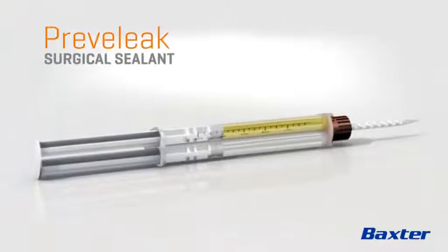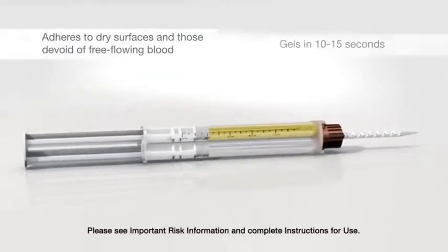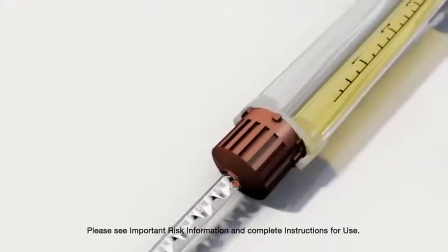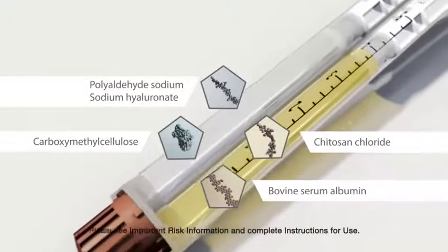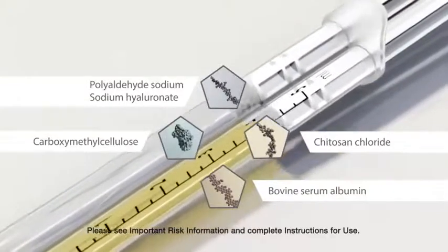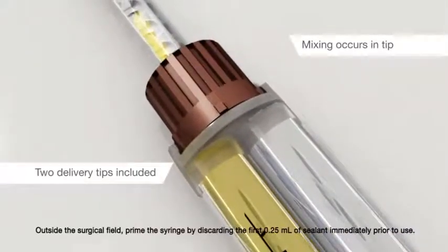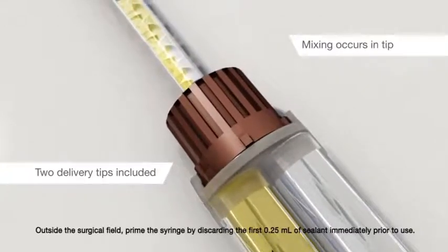Baxter Healthcare proudly offers Previleak, a surgical sealant that combines speed, strength, and flexibility. The double-barreled syringe contains equal volumes of Purified Bovine Serum Albumin and Polyaldehyde, which come fully prepared and do not require mixing prior to application. When the plunger is depressed, the mixing occurs in the tip of the syringe. Outside the surgical field, prime the syringe by discarding the first 0.25 milliliters of sealant immediately prior to use.